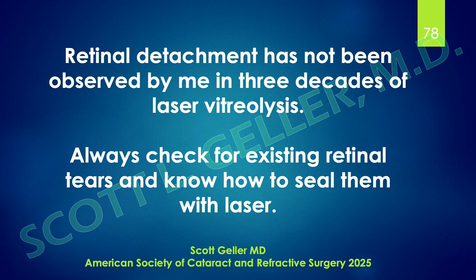This can occur with cataract surgery too occasionally, but if you see pigment cells in the vitreous, check carefully for a retinal tear and know how to seal them with laser. A patient doesn't want to be told, oh, you have to go to this doctor, you have to go to that doctor. It's like, what's the matter? Can't you do that? Well, of course you can do it if you're an ophthalmologist: see one, do one, teach one. It's not very difficult to seal a retinal tear with an argon or another green type of laser.